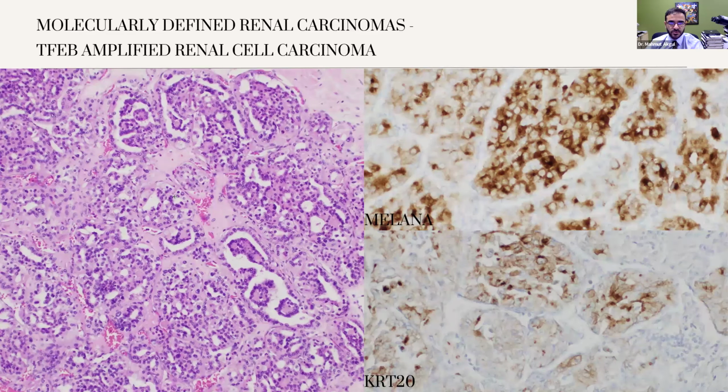And this tumor was actually known to have RBM10 TFE3 translocation. It is actually an intrachromosomal inversion type translocation. That's why FISH can be negative. And I just want to show you another example.